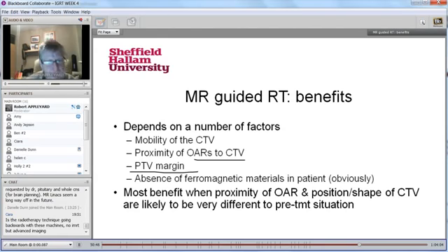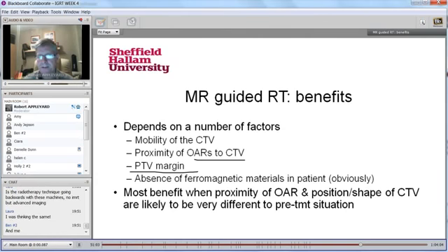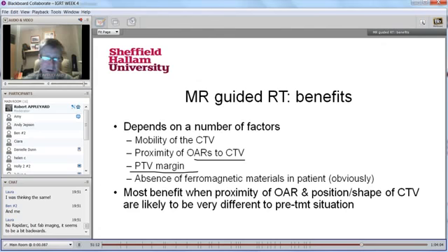Vivian, it does seem to be in the future for many sites. MRI is mostly used for staging, in some cases planning. The planning issue is something I didn't really touch on, because we devoted most of that to the pre-treatment stuff and how feasible it is to plan on MR data alone. There are algorithms that can convert MR data into modified HU units, but I don't know much about that.